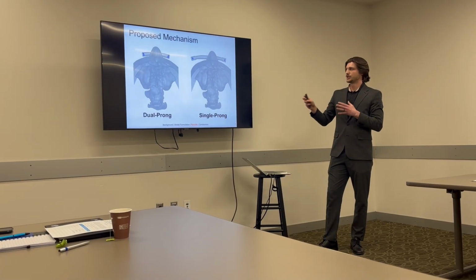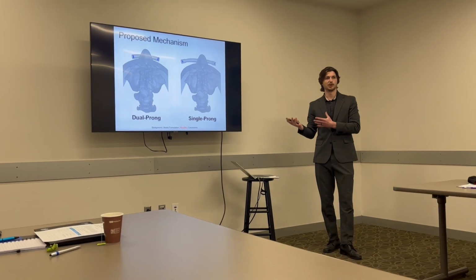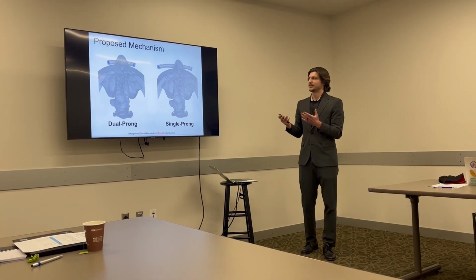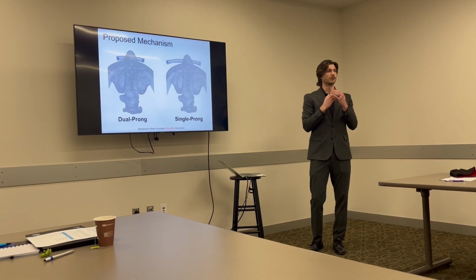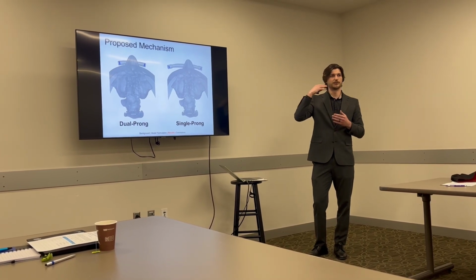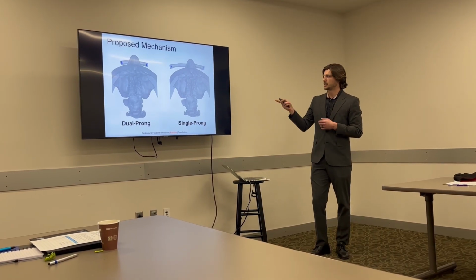Now, just to cover the proposed mechanism for why we were interested in the single prong cannula, the hypothesis is essentially that we're leaving one of the nasal passageways open in difficult to flush scenarios where the patient's mouth might be closed or mostly closed, and this would allow the stale expiratory flow to evacuate out that open nasal passageway. So some animations are going to play here.